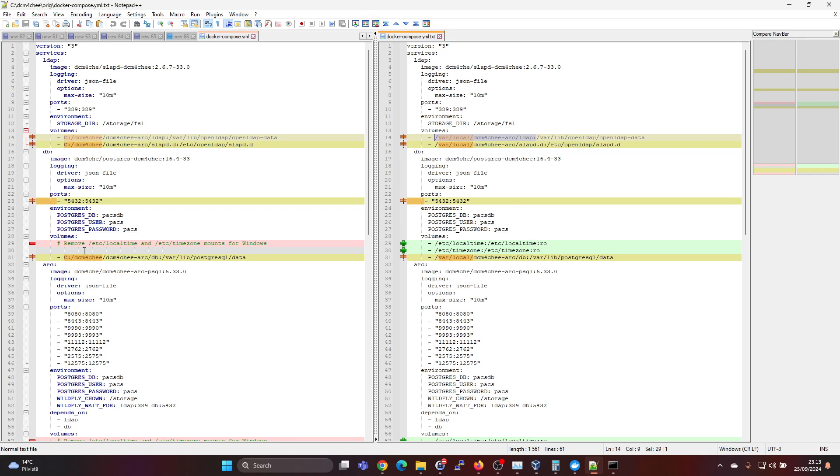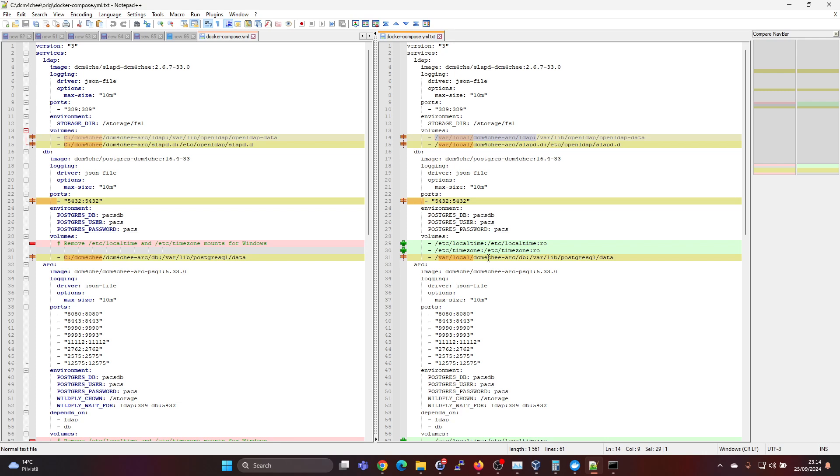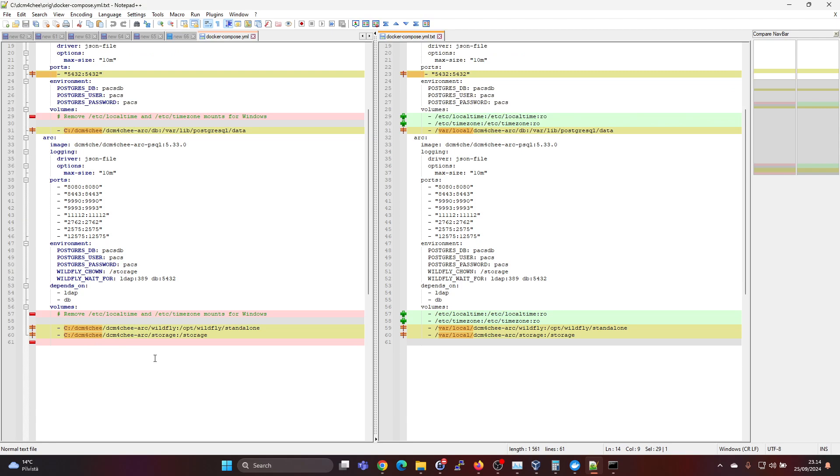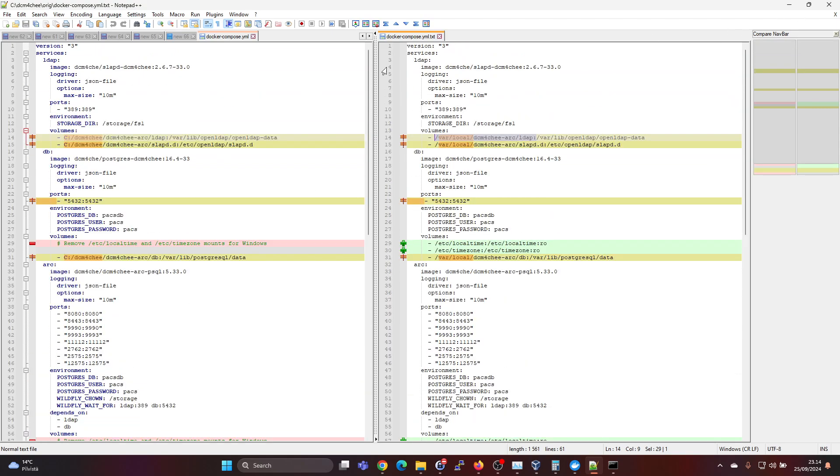And here we see that we remove those time zone things because those don't really exist in Windows in this way. We might get wrong times but I didn't go ahead and do anything about solving that now. I assume you will use this just for testing purposes. So here also the changed path for the volume. And here in the last one again removing those time zones. And again changing the paths. That's all the changes you need.